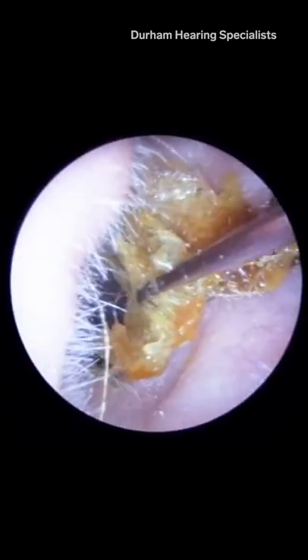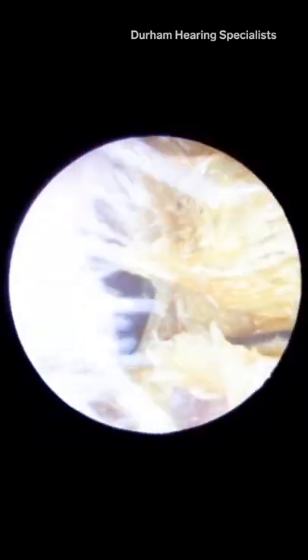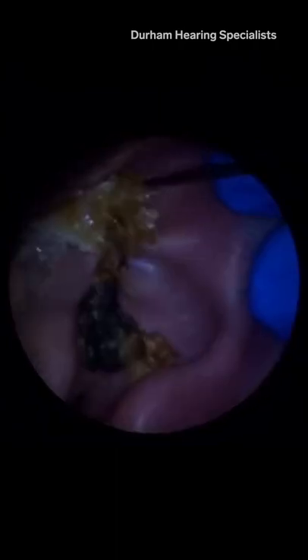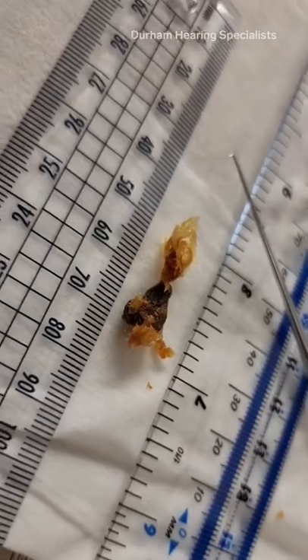The sort of darker brown bit, that's very, very dense, dry, hard earwax, which has just formed over a long period of time. It's impossible to say how old it is, but it's definitely been in there a while.